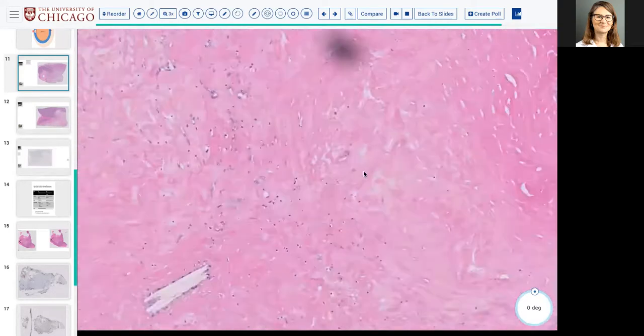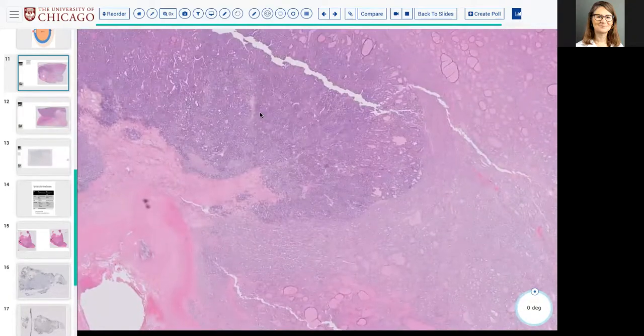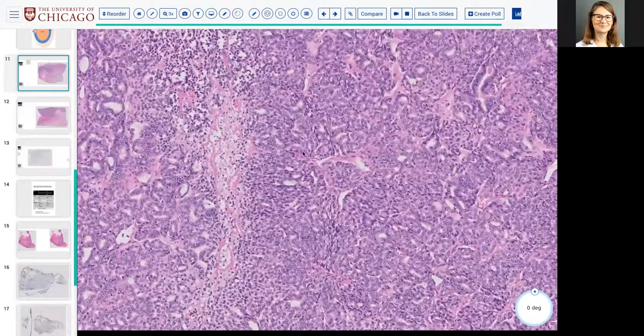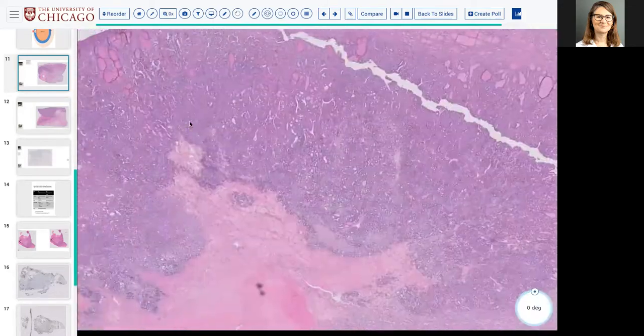Maybe this down here is FNA, I don't know, there's cholesterol, etc. But when you start to see these punctate areas of cell death, even like here with neutrophilic infiltrate surrounded by viable tumor, that is true biologic tumor necrosis, okay?